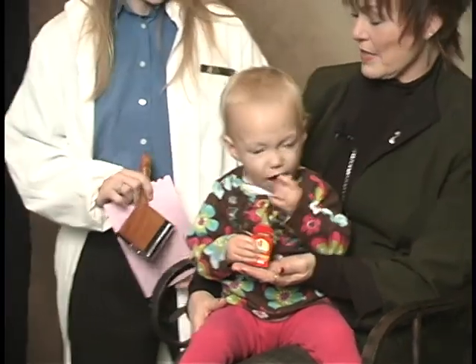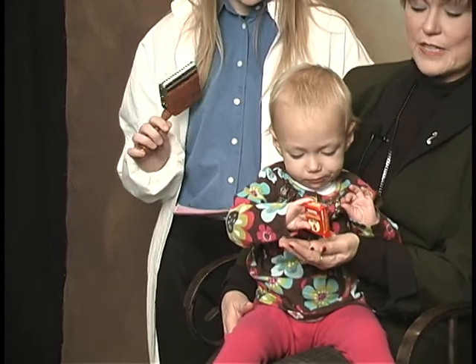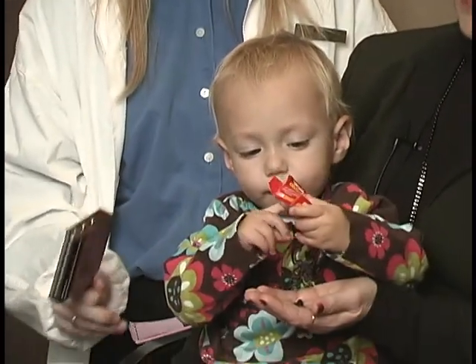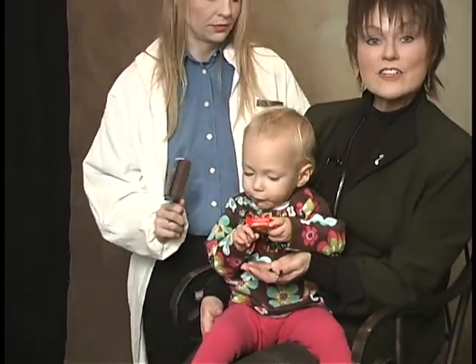The next sound maker is going to be a low frequency cricket. Let's see what she's presented on. As you can see, the 18-month-old child locates directly on the sound.